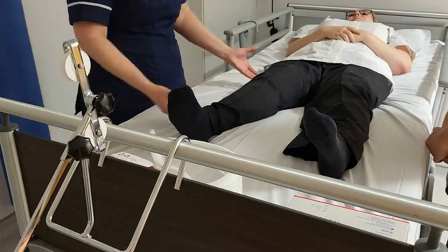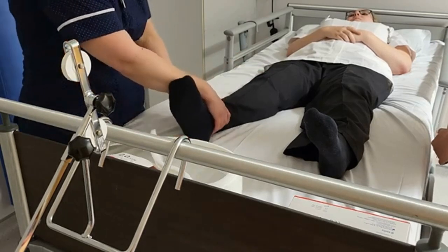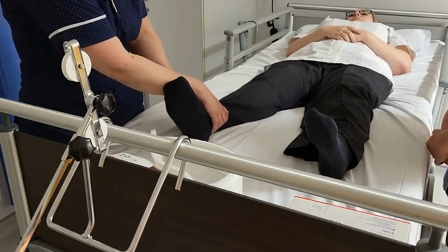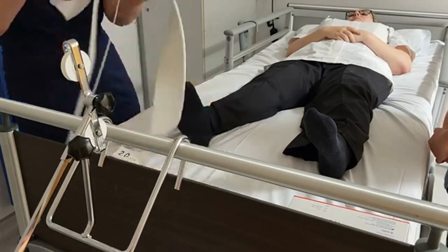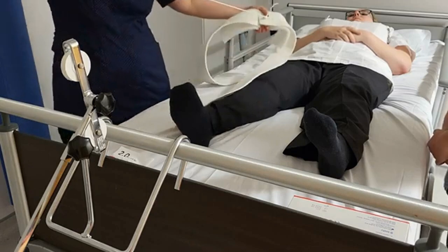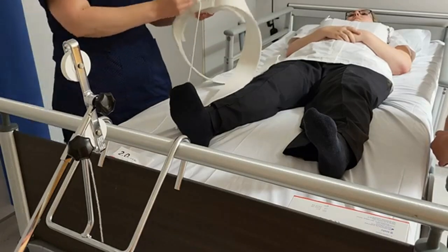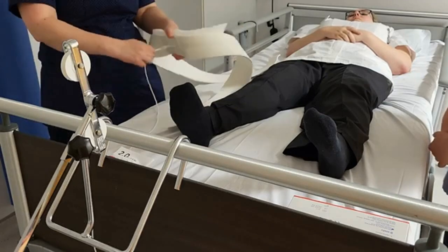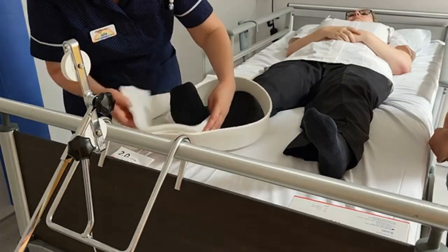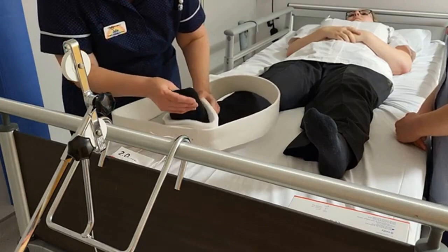You've got the person putting on the traction, somebody to hold and assist, and you may well have the orthopaedic registrar present holding the limb and providing traction while you're applying it, which will keep the child comfortable. We get our non-adhesive traction set with the double strings pulled through to give a long single string, and the knots tied at the bottom with a clove hitch knot. We place the traction foot end around the foot, allowing room in the gap for the child to wiggle, flex, and point their toes.